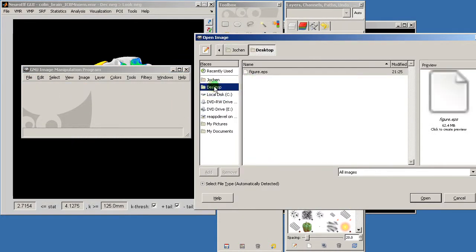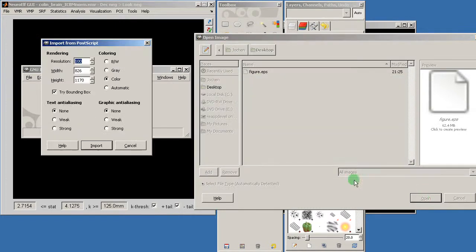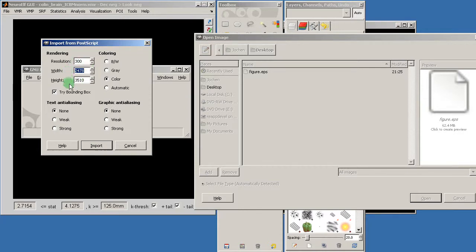So if I now click or select this file it asks for which resolution I want to render this in, and 300 dpi is already relatively high. High resolution as you can see, the image will be 2,500 x 3,500 pixels.